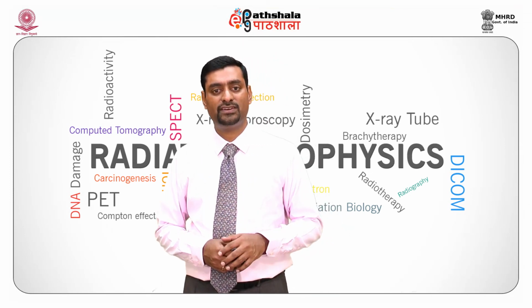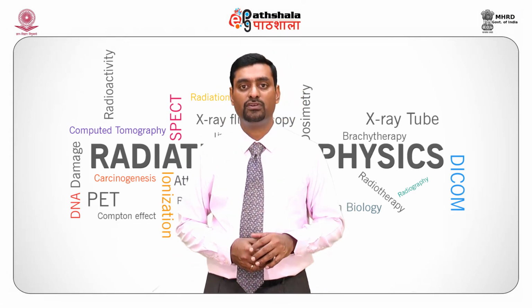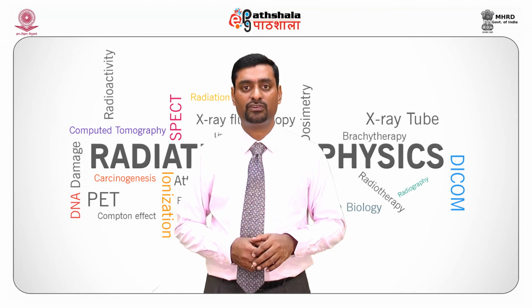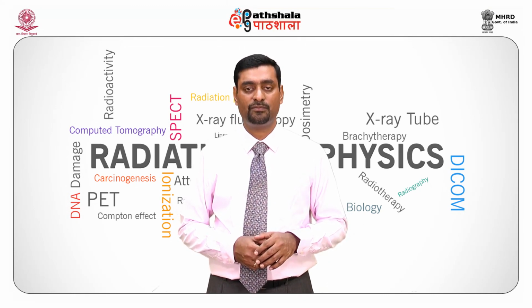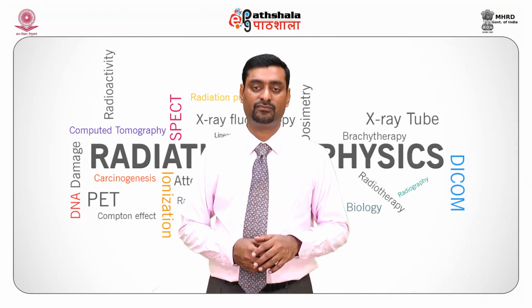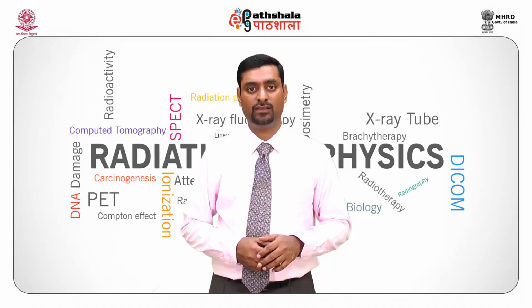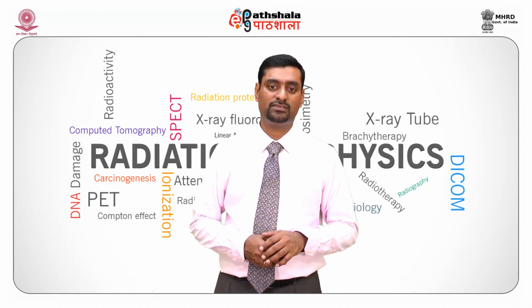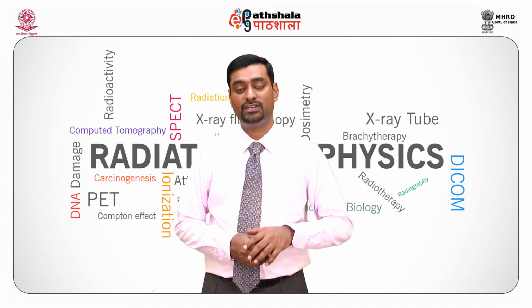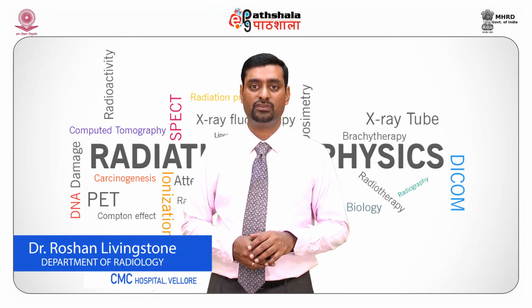The use of an intensifying screen is to convert X-ray energy into light energy by the principle of fluorescence. To get maximum film blackening from least radiographic factors, films need to be matched with intensifying screens, more precisely, the color of the intensifying screen. It is important to maintain the pH for both developer as well as the fixer. Temperature of the developer and fixer are very important and crucial in chemical processing of the film.